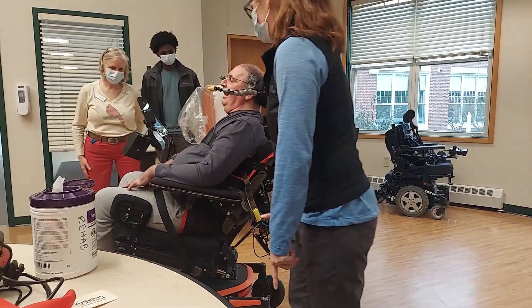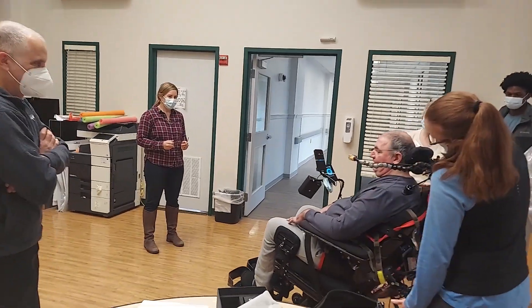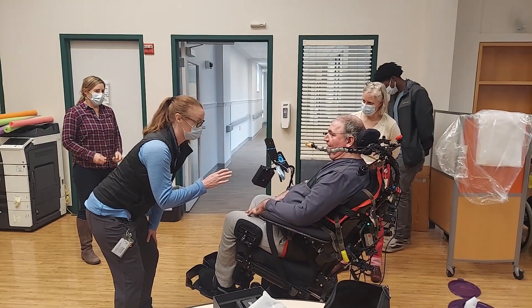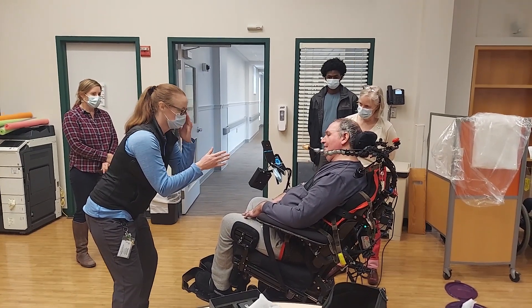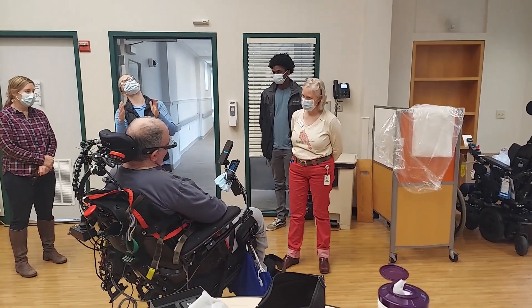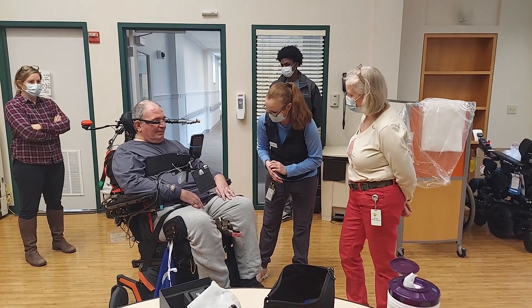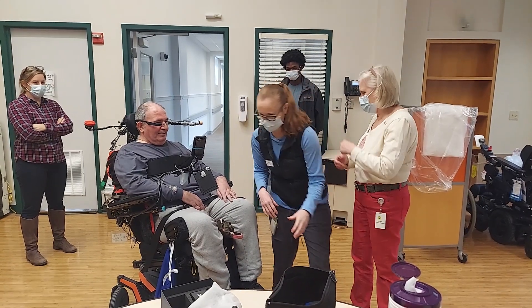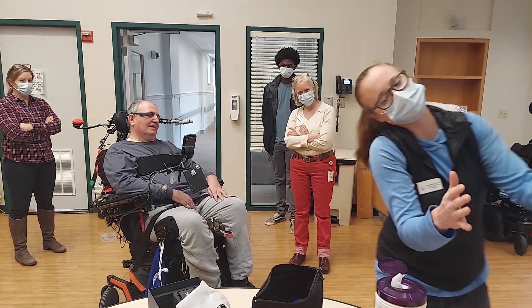I want you to keep your head back a little bit and now turn a little bit — ear to shoulder. On your single switch scanner, you know how you have to stop and make turns? He's used to a single switch scanner, he's not used to being able to do this. This is more fluid — you don't have to stop and do a discreet forward. I can go like this, going forward and then move my head and make a nice turn.